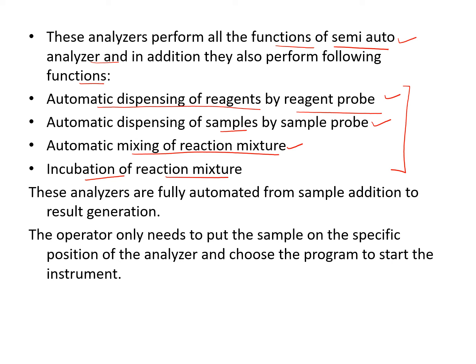Okay, so these functions are done by the fully automated analyzer, and along with that the reading, display, result, printing, and then memorization, these all are done by the machine only. So all functions are done by the machine only. So that's why these analyzers are called fully automated analyzers. These analyzers are fully automated from sample addition to result generation. From adding the sample to generating the result, who is doing all the work? Only the machine. That's why these analyzers are called fully automated analyzers.